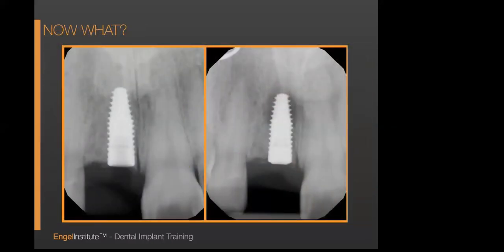Uh-oh, pitfall. So here's the implant at 30 days.